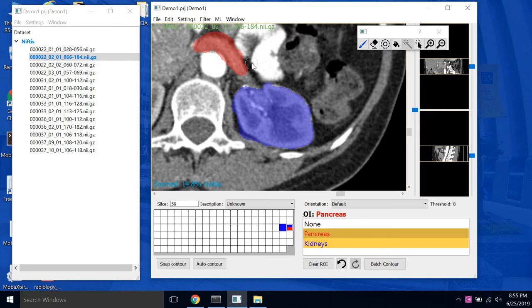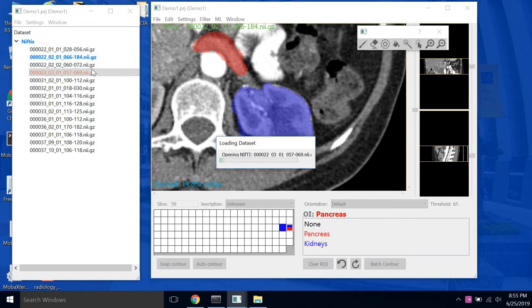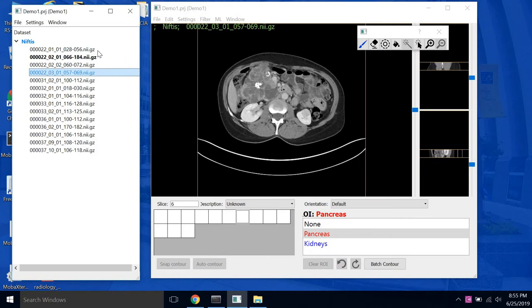One other thing I want to mention. So in the project window here, you'll notice that the scan we have selected is now bolded. RealContour automatically bolds any scans that you've already edited. So if we click on a new scan, you'll notice it's easy to keep track of whatever scan we were editing.